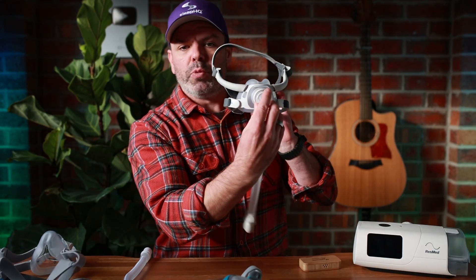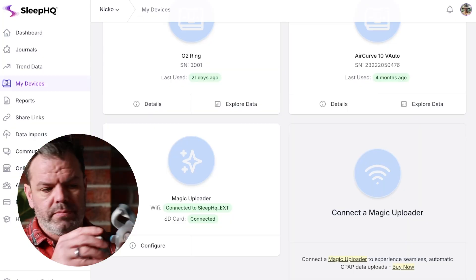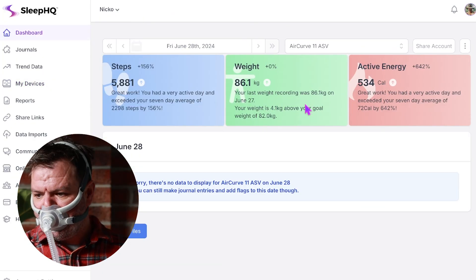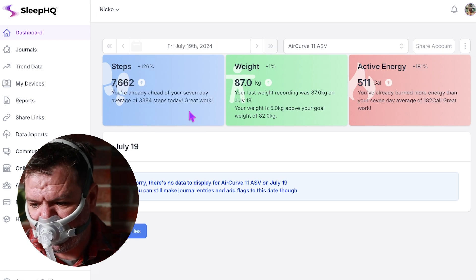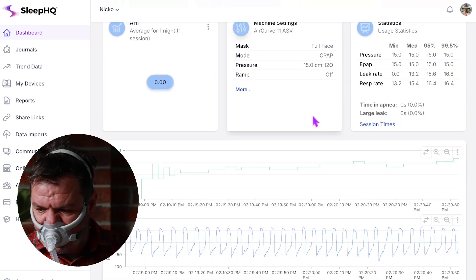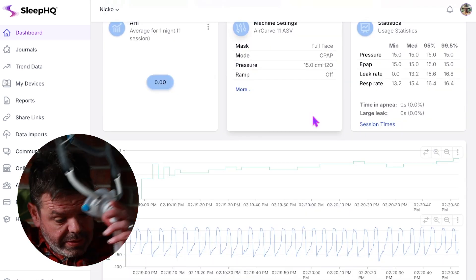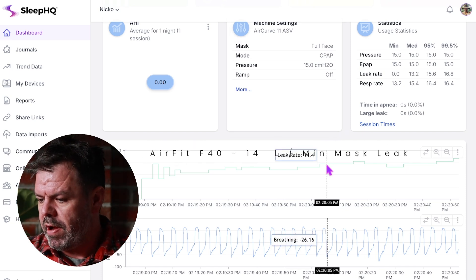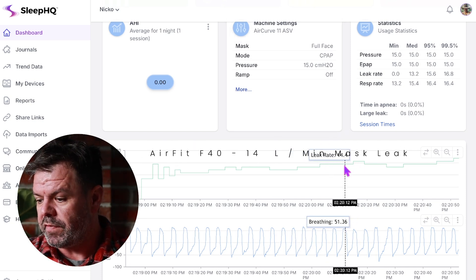All right, off we go — starting with the F40. Leak rate around 14-15 litres per minute.